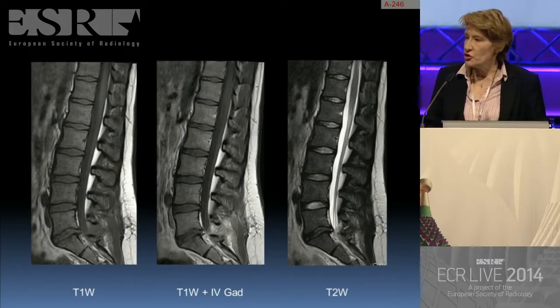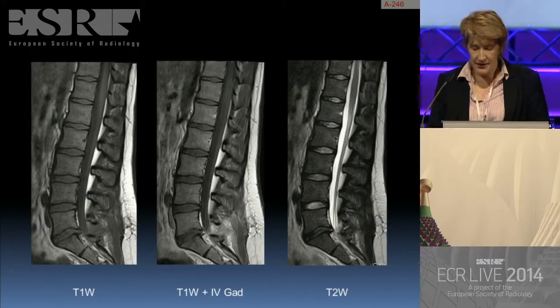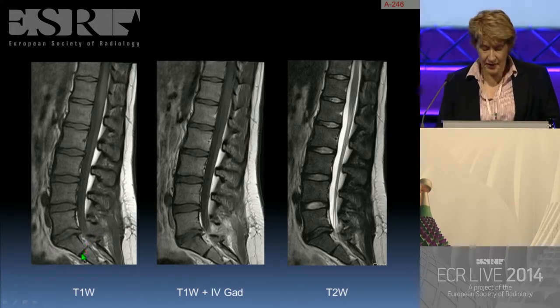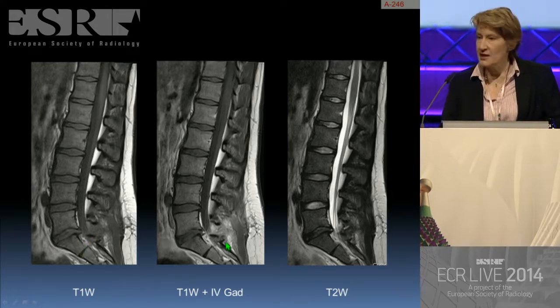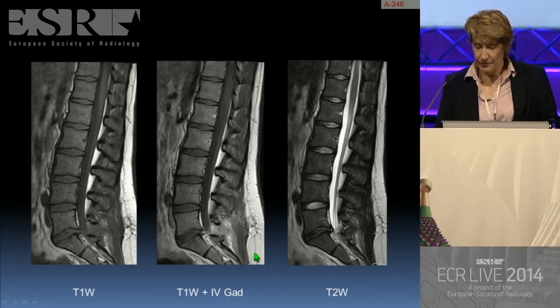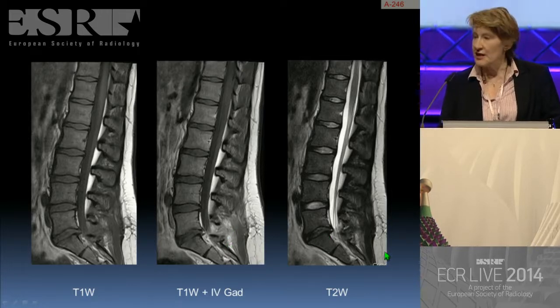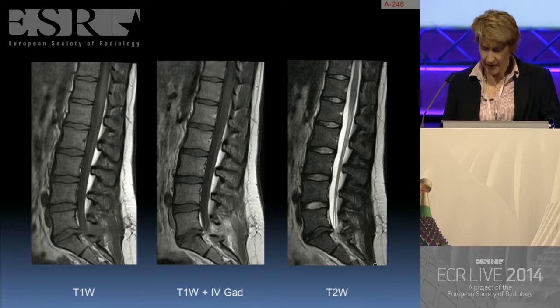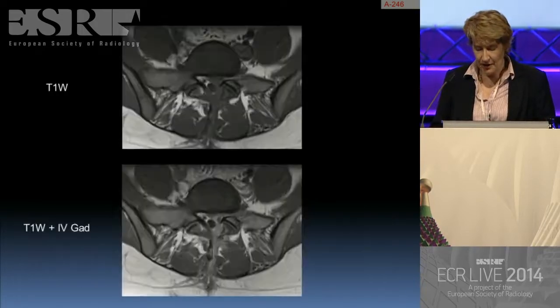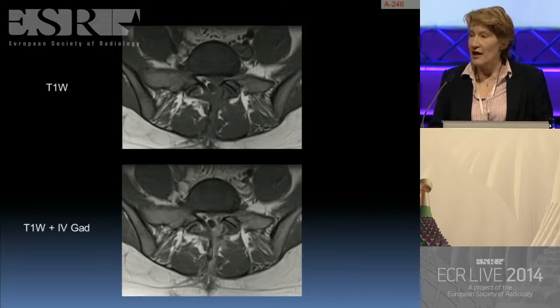Just going to show you two slides. Here you can see we have the sagittal T1-weighted image, a T1-weighted post-intravenous gadolinium, and the sagittal T2-weighted image. Just remember that the previous surgery was performed at the L5-S1 level on the left side.